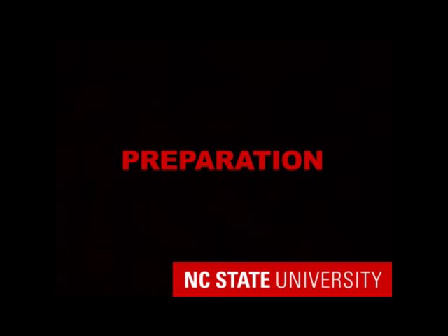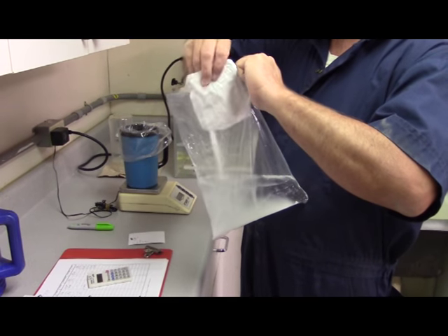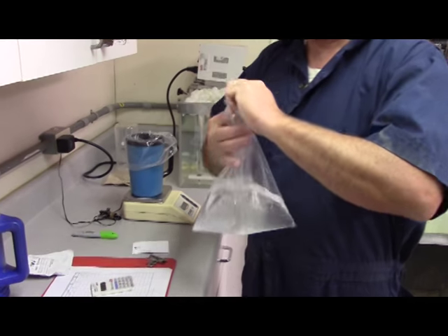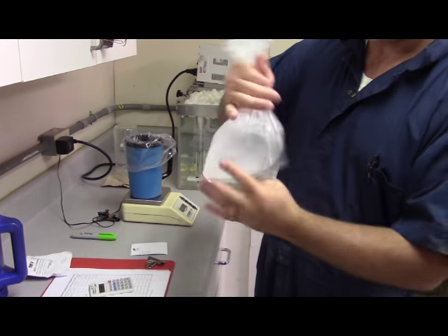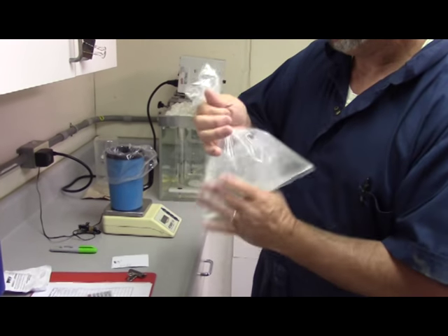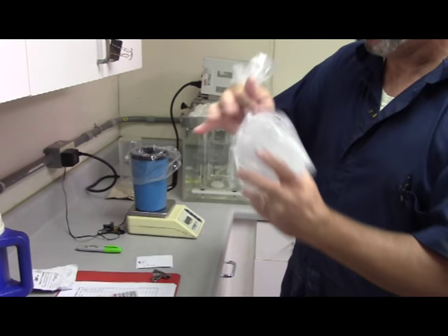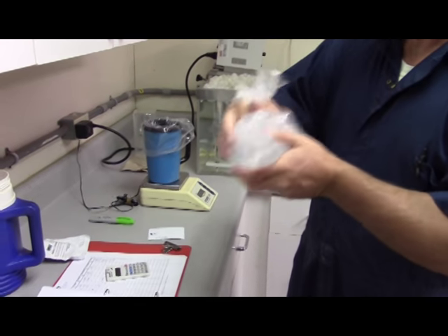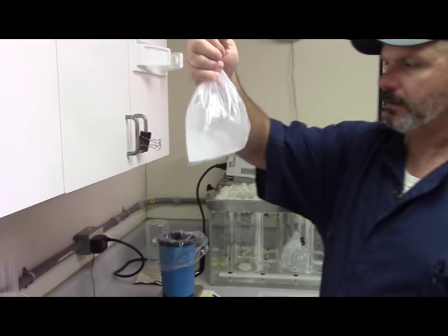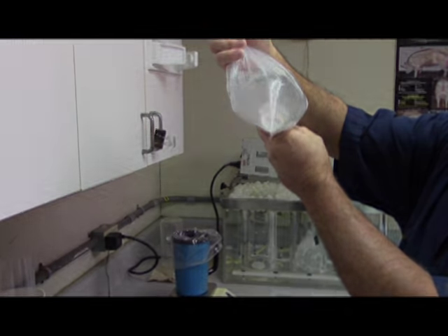It's best to prepare the extender at least 1 hour, but no more than 24 hours, prior to collection. This allows adequate time for the solution to evenly mix and stabilize. Prepare the extender at room temperature and in a clean room, such as the kitchen. Mix the extender according to label instructions, usually one package to 1 liter of distilled water, in a single-use plastic bag until the extender powder is fully dissolved. Then place the bag in the water bath and heat to 99 degrees Fahrenheit. The extender will remain here until we're finished collecting and ready to process the semen.